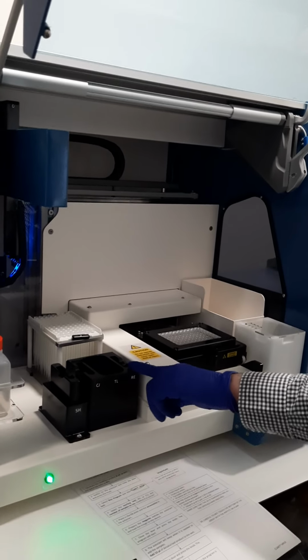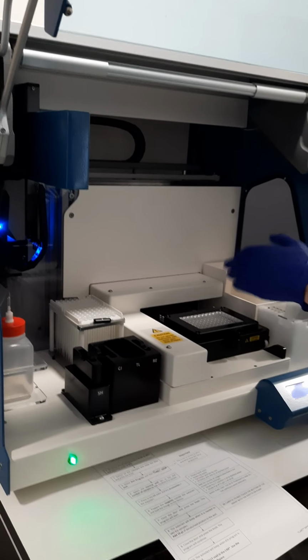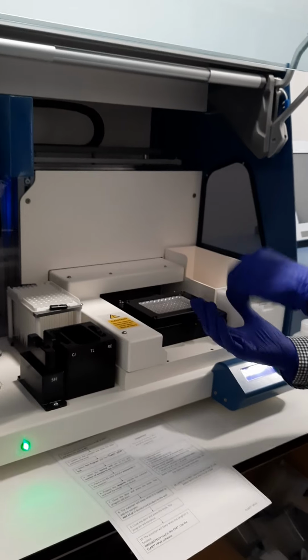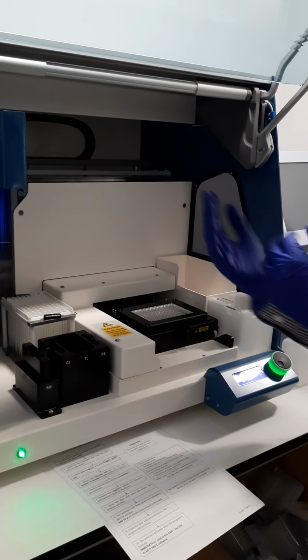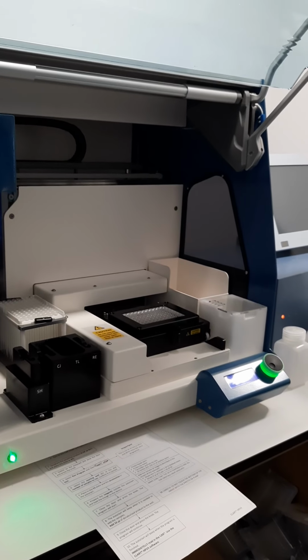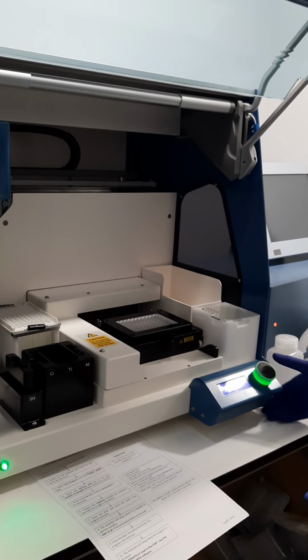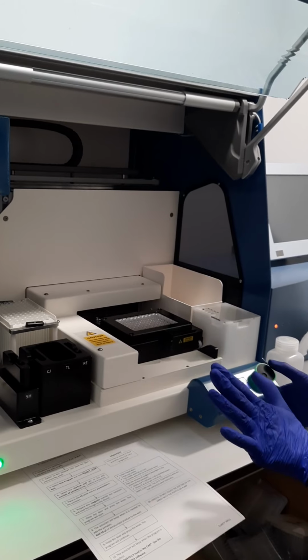Okay, we have here the hybridization solution, and it's going to add. So what we are going to see is a precipitate where this hybridization has happened, detecting this microorganism, or the HPV in this case. So this is all.